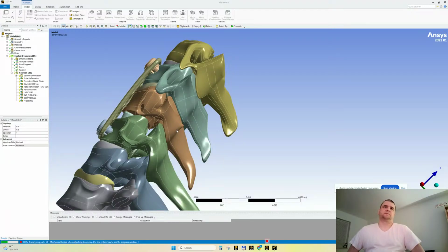Now it will make more sense. It will make all the sense in the world having two cages. It's not possible to fixate, to restrain something having a flexible element. Yeah, this disk was in the way and it made no sense. This is why a smaller plate was used for one cage. We have a larger plate, then we're going to use two cages.